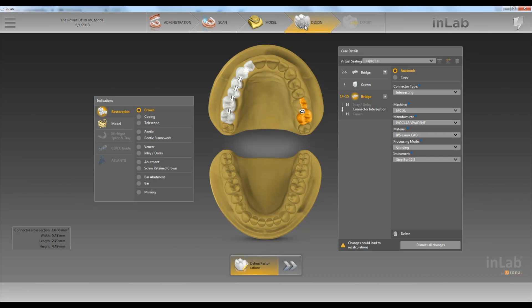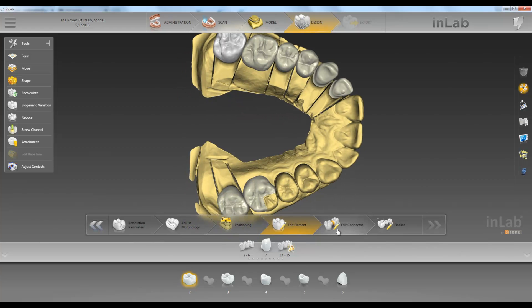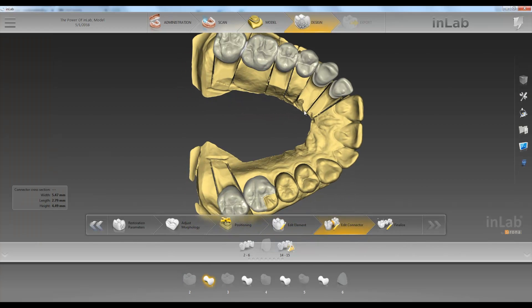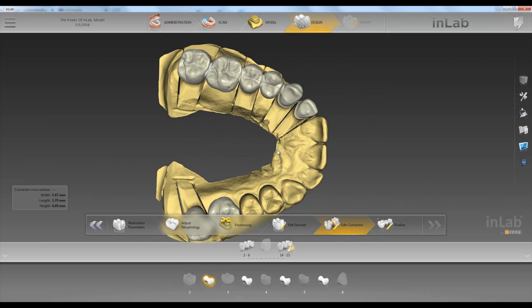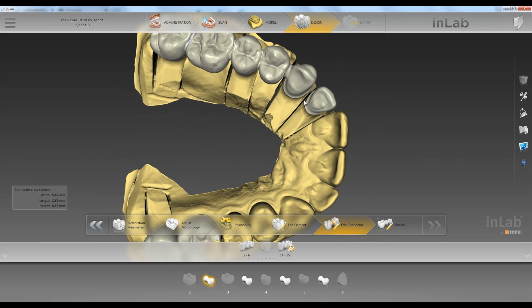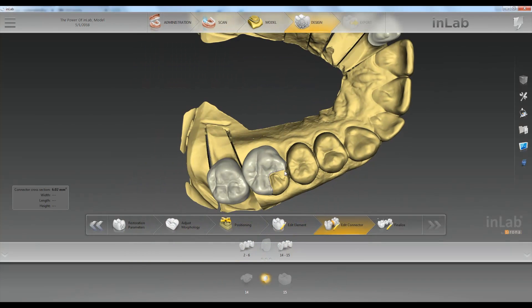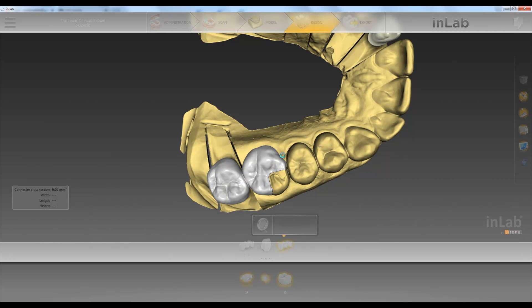So we go back up to design, then click on edit connector. You'll see now that this is a single unit and not part of the bridge, and when we click over here on our bridge, you'll see this is now a single unit.